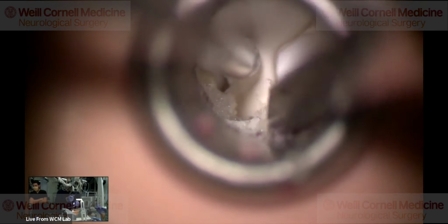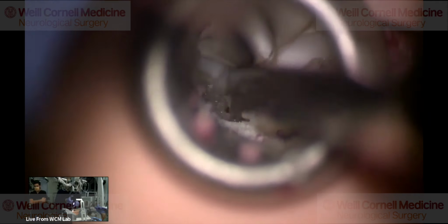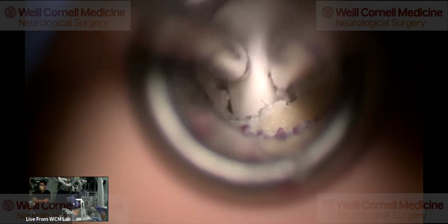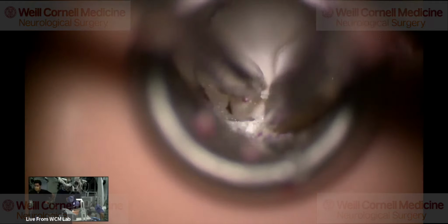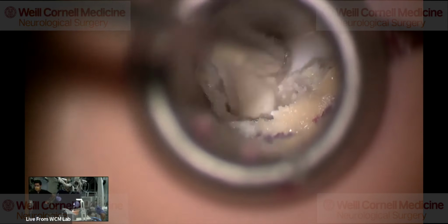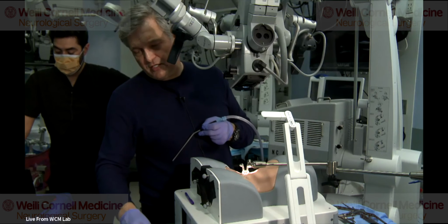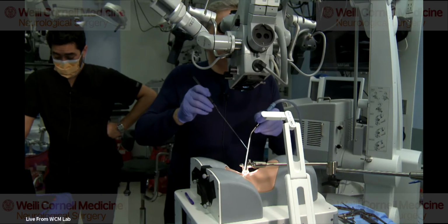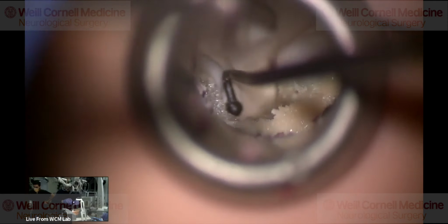Do you use neuromonitoring for these patients? I don't usually, but we recently used a monitoring system where you put those patches on the muscle pre-op, and then you can stimulate nerve roots. I've used that recently for my cervical foraminotomies to confirm that the nerve root stimulates at a low level, and I find that really helpful, because one of the challenges here is always that you don't know, are you really done now with your decompression? We use all these things to evaluate that, but at the end of the day, you're never really 100% sure.